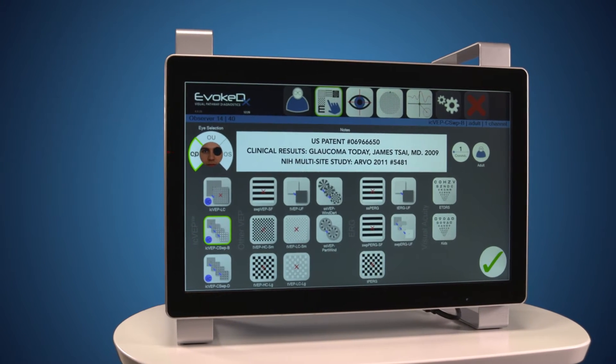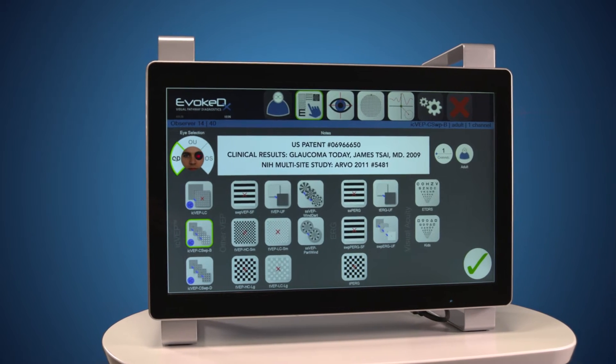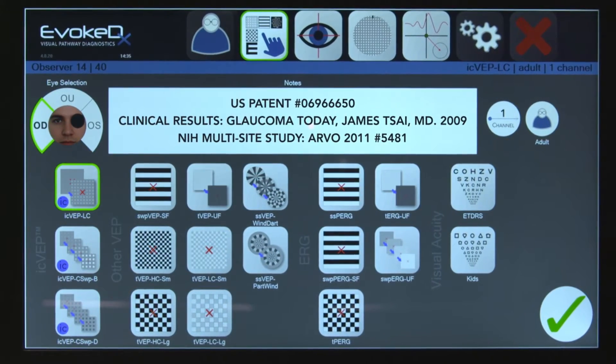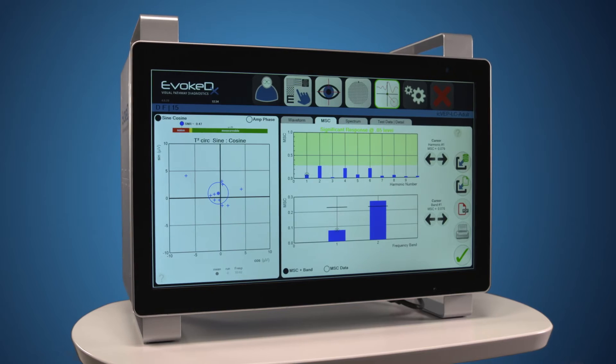Evoke DX has 16 VEP and ERG test conditions, including three patented isolated check VEP tests designed to elicit responses from the M-cell pathways.